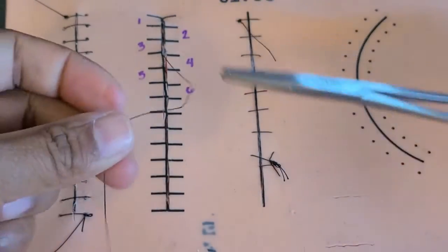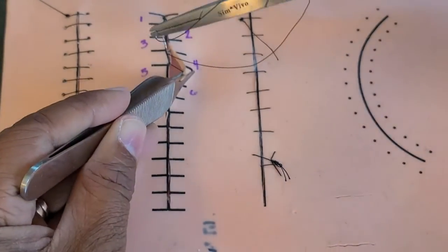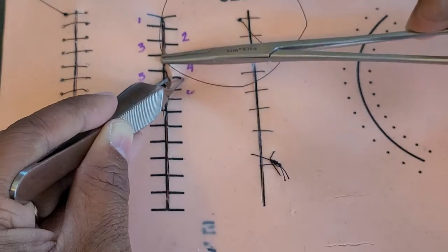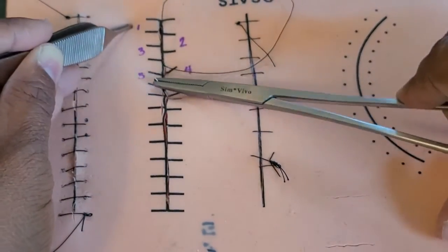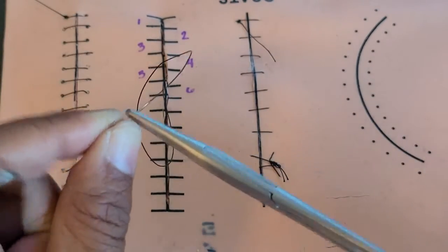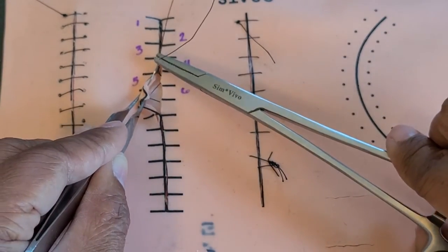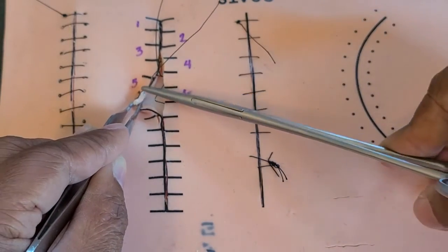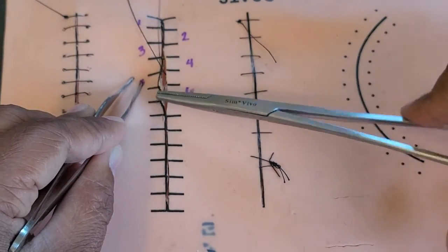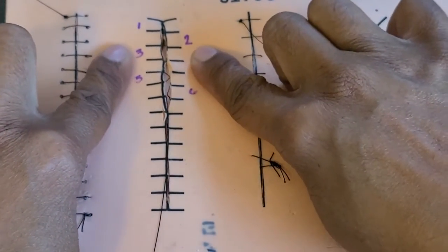You want to make sure you adequately tighten it as you go, especially if that patient's skin is already kind of frail. You don't want to do a final pull through at the very end. You want to pull as you go. Again, I'm going to show that it is closing.